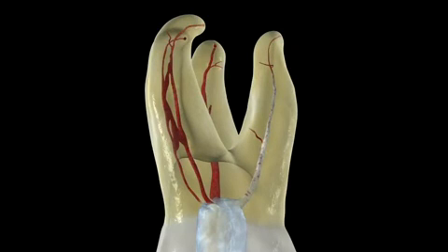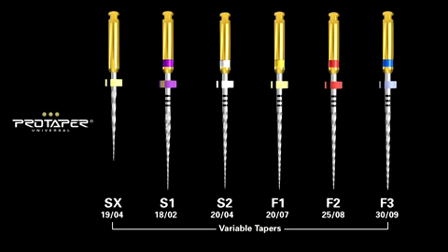Notice, however, there's still an awkward triangle of dentin. Notice the canal is still badly underprepared, but we have a glide path. That's what we're talking about, having a glide path to accommodate passively and safely mechanical shaping files. Now that we have got a glide path, let's digress for a moment and talk about the files that we'll use for shaping this canal.